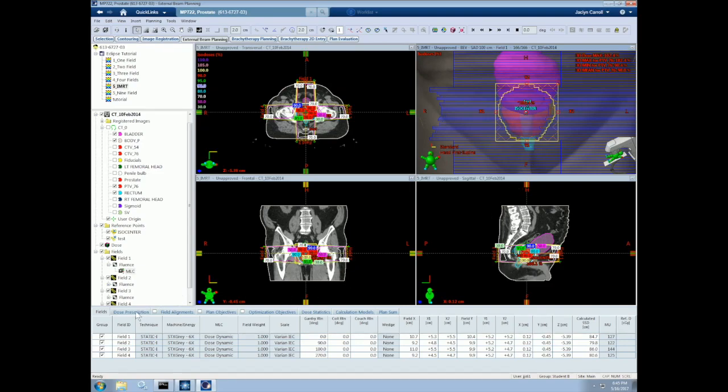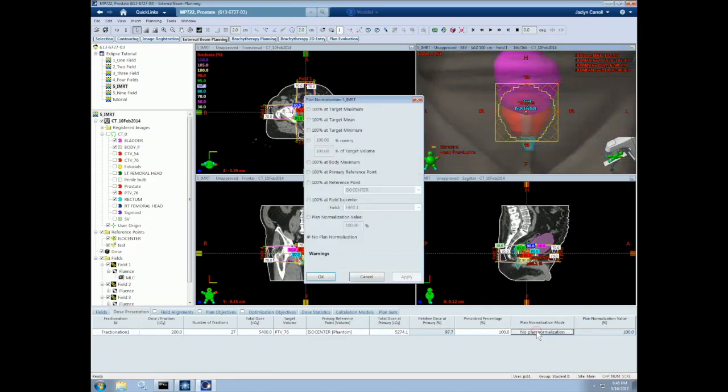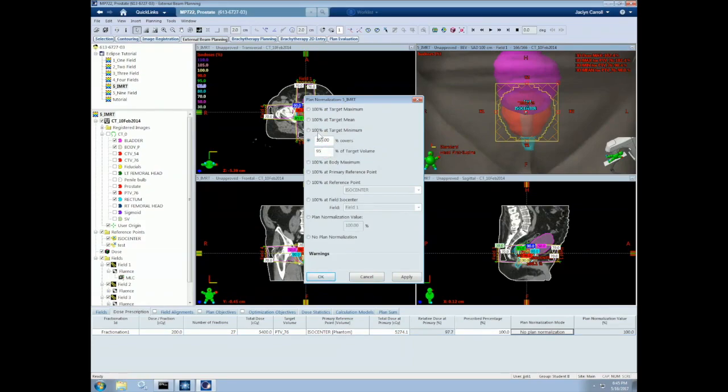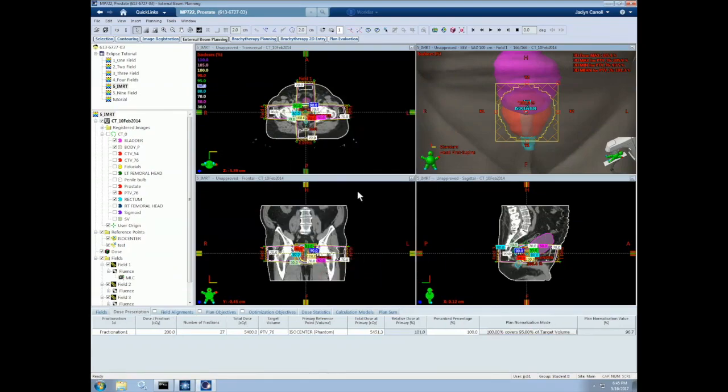Let's now normalize our plan. Go to dose prescription, plan normalization mode. Let's select that 95% of our target receives 100% of the prescription dose. And we now have our four-field IMRT plan.